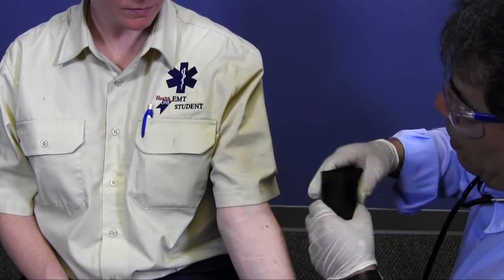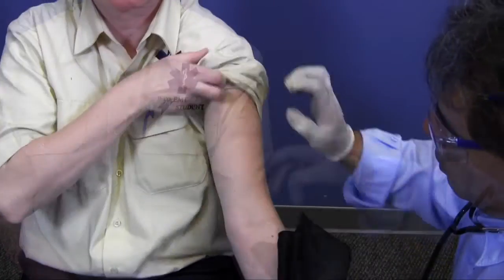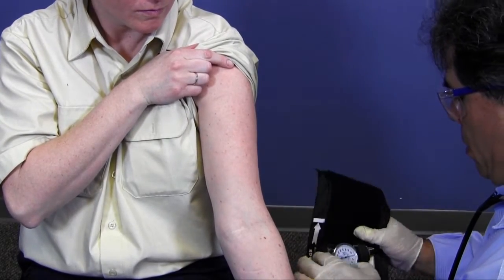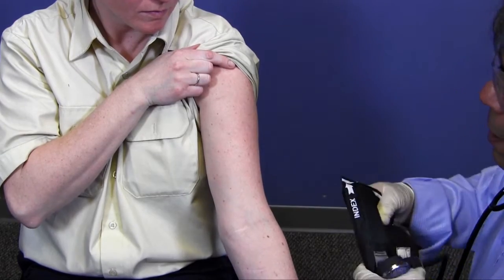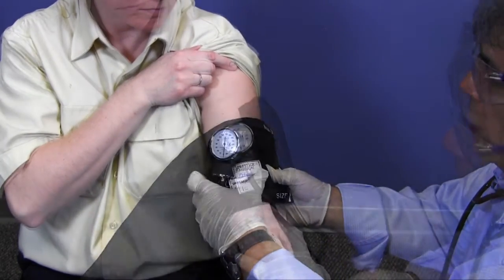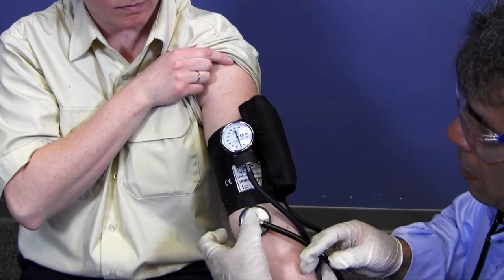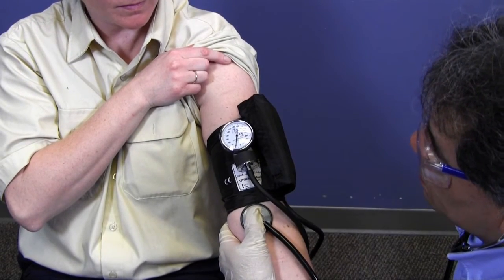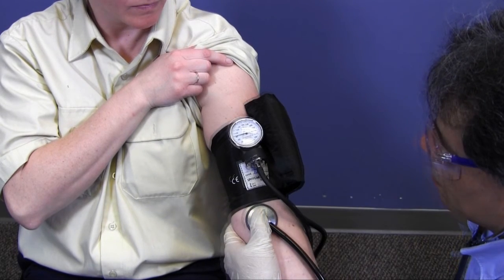First, I am going to demonstrate how to take a blood pressure. I will make sure I have the properly sized blood pressure cuff and stethoscope. Next I will apply the proper size cuff above the arterial point. I will locate an arterial point distal to the cuff. I will place the diaphragm of the stethoscope on the arterial point. I will inflate the cuff above the Korotkoff sound.